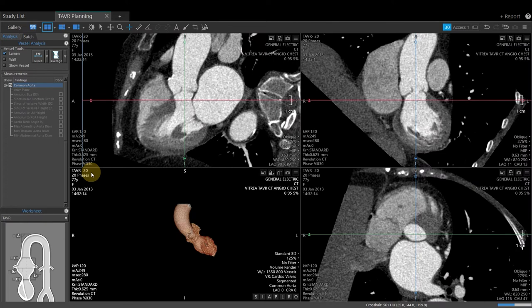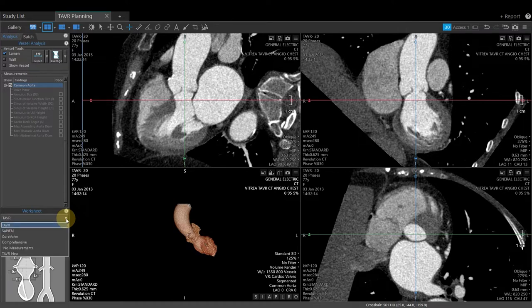Upon loading the exam, the software will automatically apply segmentation and get us close to the valve plane. There are a few worksheets built into the software that we can select for our workflow. These are at the bottom left-hand corner of the screen, available by clicking on the drop-down. Choose the worksheet closest to your needs; you can also edit and create custom templates when needed.